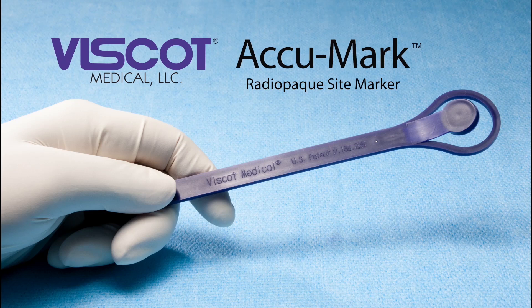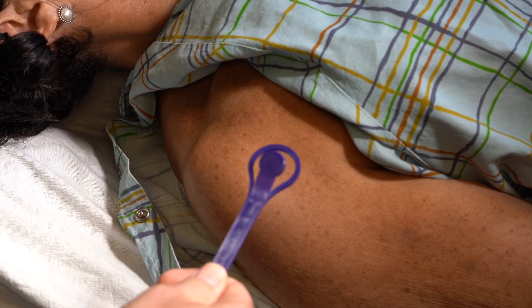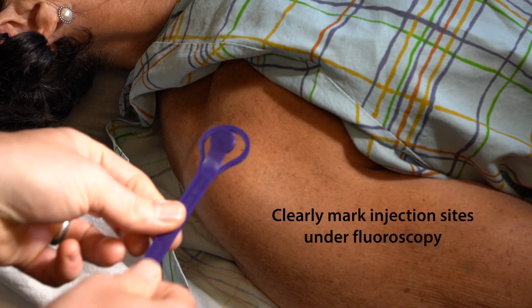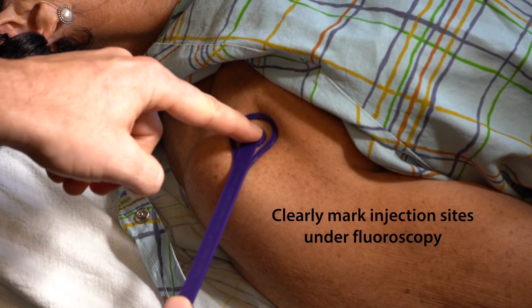Viscot Medical, the global leader in surgical site marking, introduces the Acumark, a device designed to precisely locate and clearly mark injection sites under fluoroscopy.